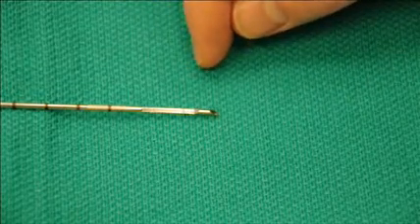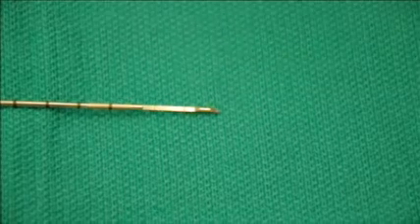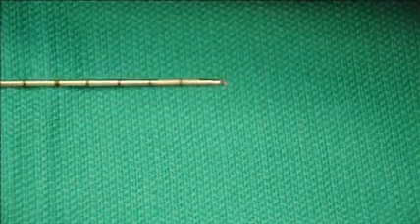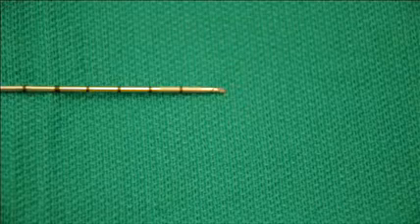The needle notch is then pulled back to straddle the wall of the stomach in order to enable a full-thickness gastric biopsy. Once the location has been ascertained, the needle is fired, taking a full-thickness gastric biopsy. The needle assembly is then removed in total, and the biopsy is removed. The process then may be repeated through the same percutaneous incision up to 4 times in the same patient.